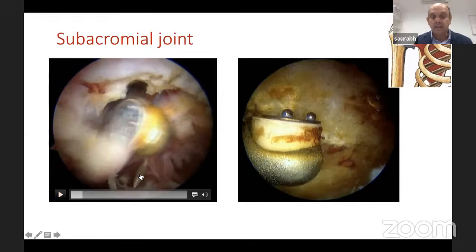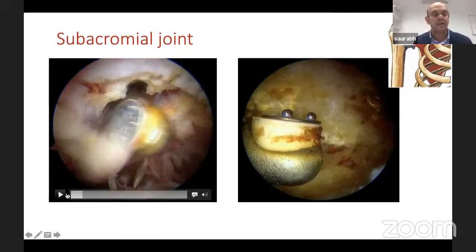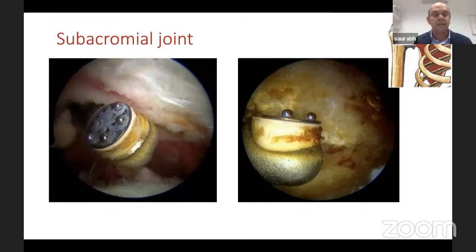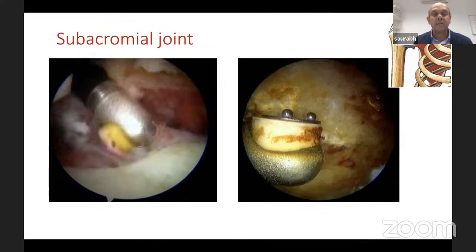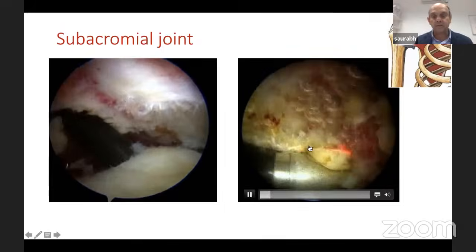So I want to show you, okay, there. Can you see this needle? Now, remember we found it was a very small anterior edge tear. So at that stage, I put a small needle into the glenohumeral joint. So this needle, I knew, was right over my cuff tear. So sometimes with a small cuff tear, when you're in a subacromial space, this needle will straight away take you to the tear and save you a lot of time and hassle. So I know again that my tear will be somewhere next to the needle, and you will see in a minute how I'm going to find my tear with my diathermy. Like I'll just probe it. So see, once I've debrided all the bursa and the tissues, so that's my tear. Oh, sorry.